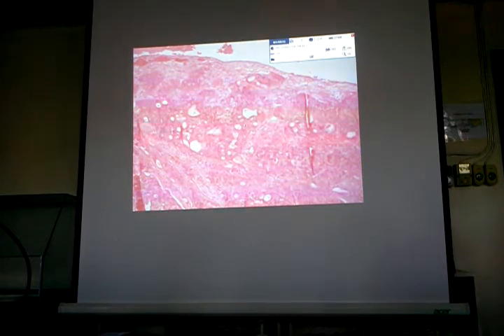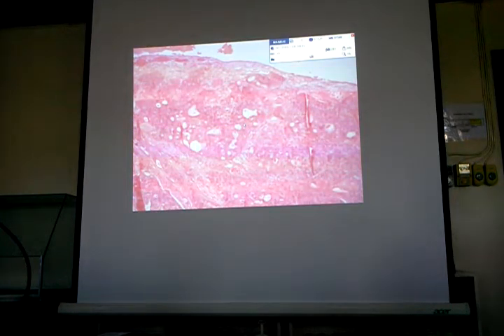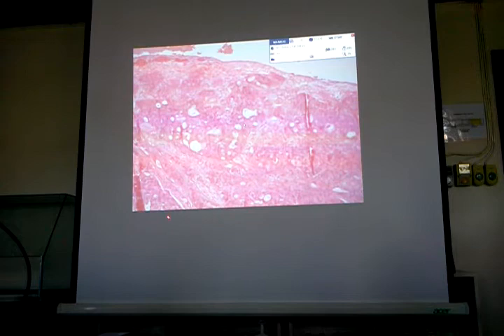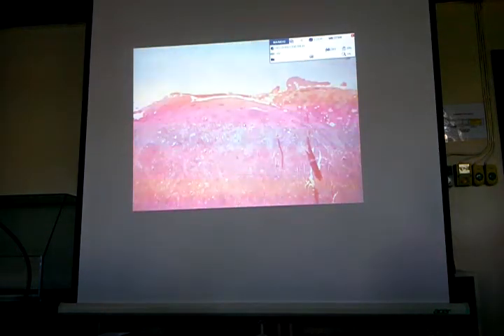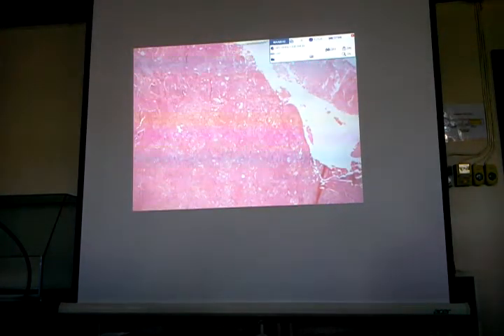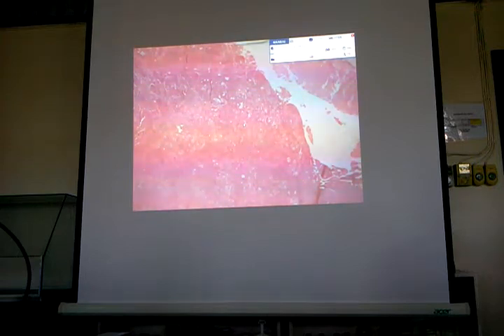And then evidence of malignancy, aside from the nuclear features that we have already mentioned, is the infiltrative characteristic, the infiltrations that are already present in the adjacent connective tissue. Ayan. So, mucoepidermoid carcinoma is the most common type of malignant neoplasm that will develop in the major salivary gland.